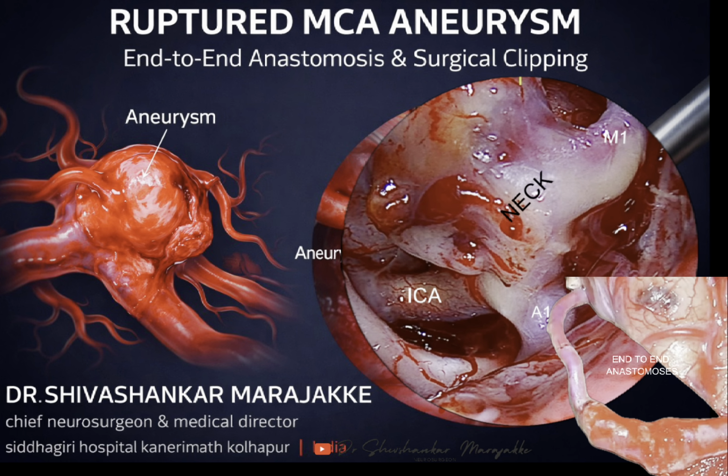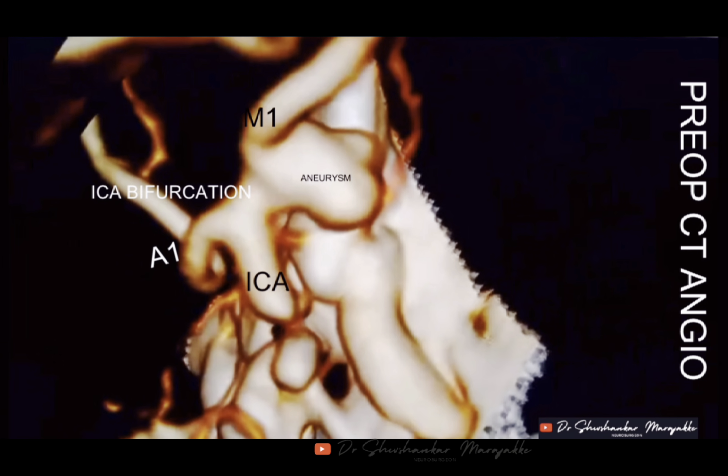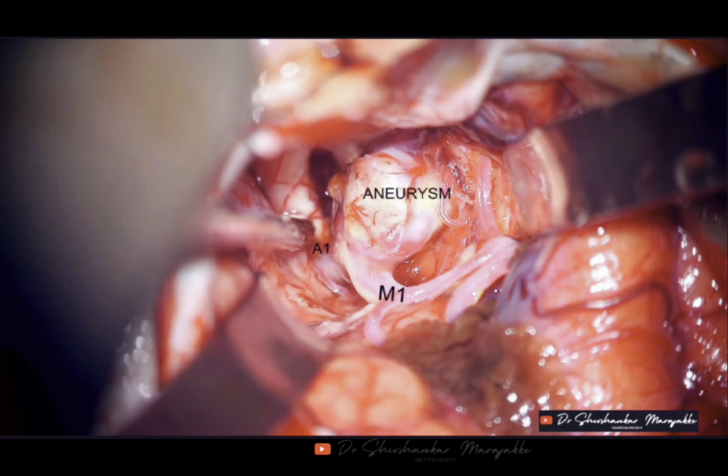Namaste. This educational surgical video demonstrates surgical clipping of a ruptured MCA aneurysm and unplanned end-to-end anastomosis of STA with MCA. It is a step-by-step demonstration. For a glimpse, you can notice here a broad neck, large M1 MCA aneurysm. This is the surgical anatomy. You can see the microscope view and even the endoscope view here.